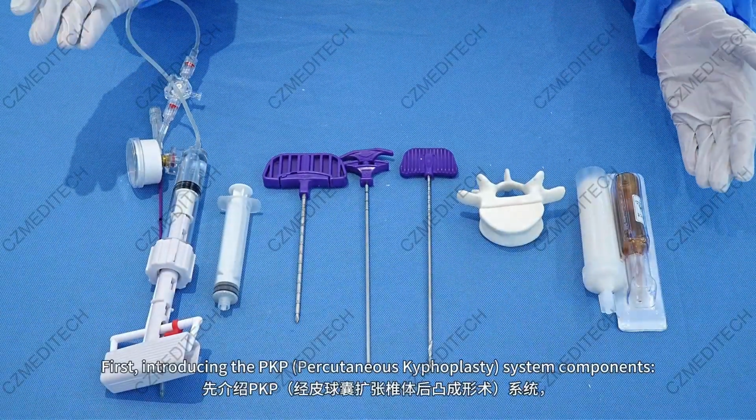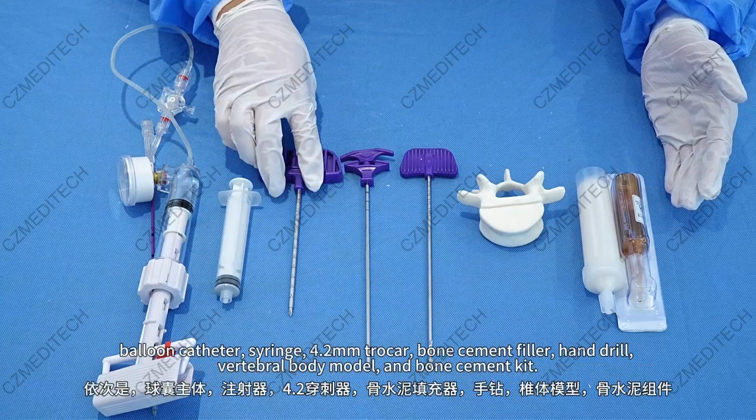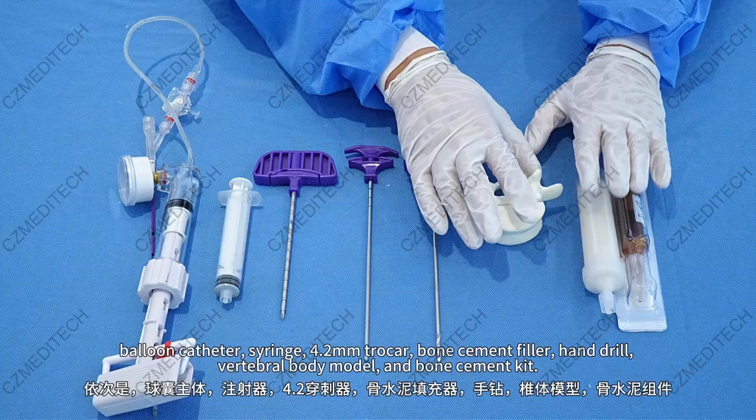First, introducing the PKP percutaneous kyphoplasty system components: balloon catheter, syringe, 4.2 mm trocar, bone cement filler, hand drill, vertebral body model, and bone cement kit.